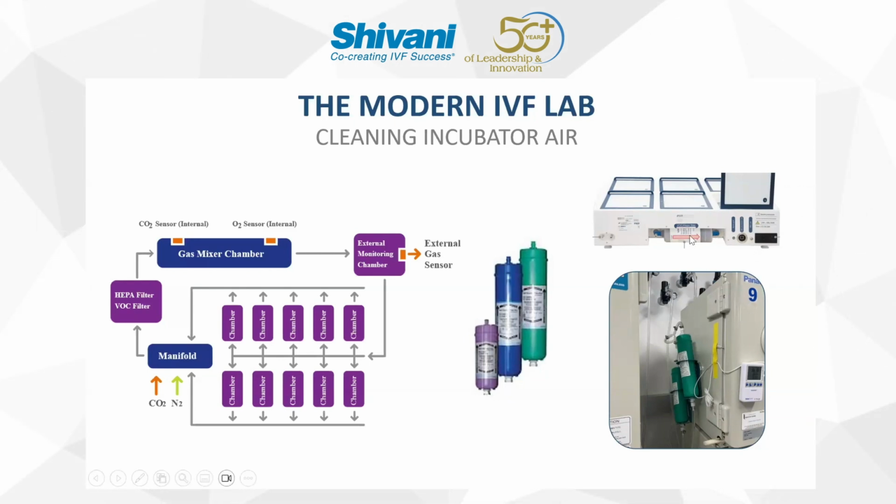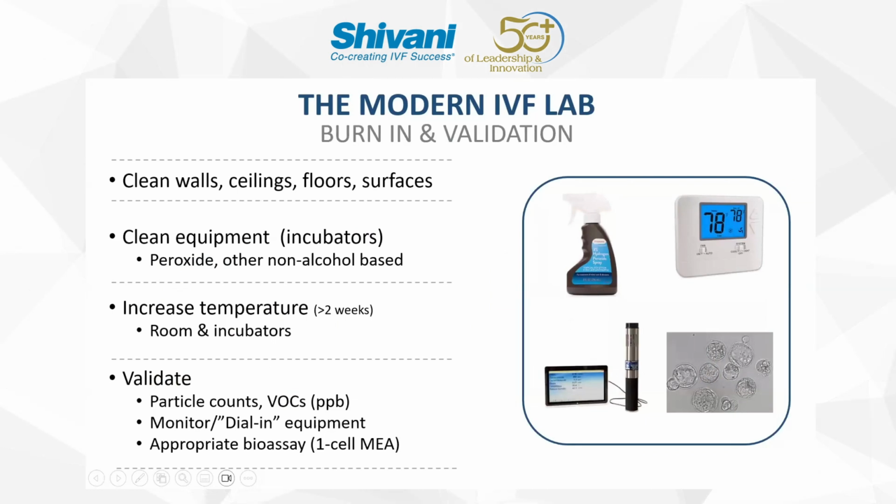But many of the modern incubators have internal air filtration specifically for VOCs. You can see one example here. So that's a nice addition. You can even convert existing older incubator technology by putting on some of these external VOC filters and particulate filters. So whether the VOCs are coming from plastic material, the lab itself, or even the med gas supply, which is another area of discussion, these filters can help address some of that to make sure that they're not accumulating in your incubators.